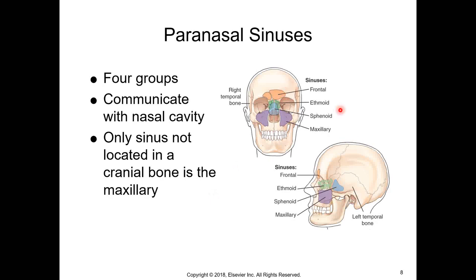And if you look over here, the AP and the lateral of your sinuses, you can see a few different things. So here is your frontal sinuses. Those aren't usually ever going to be symmetric, and depending on male or female, they can be bigger or smaller. You've got your maxillary sinuses here, and your ethmoids are the green coloring, and then posterior to your ethmoid is the sphenoid, but if you were to take an AP radiograph, you really wouldn't be able to determine the sphenoid in that direction.